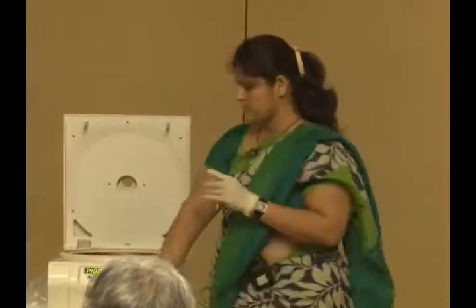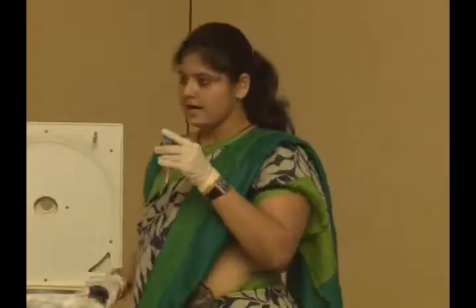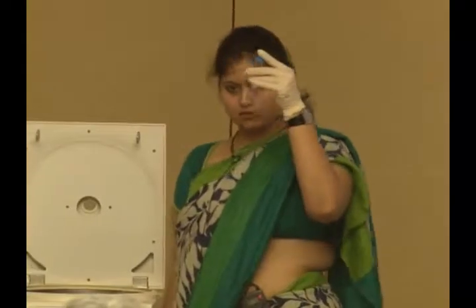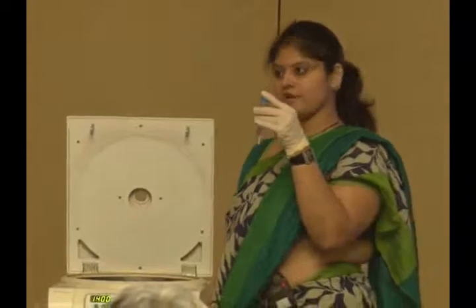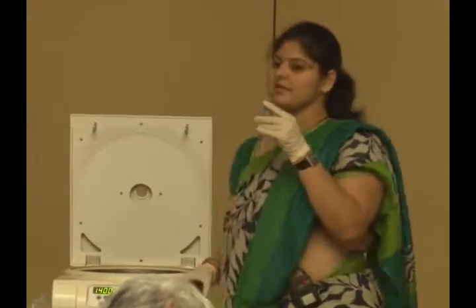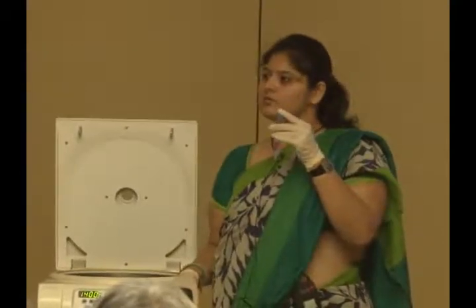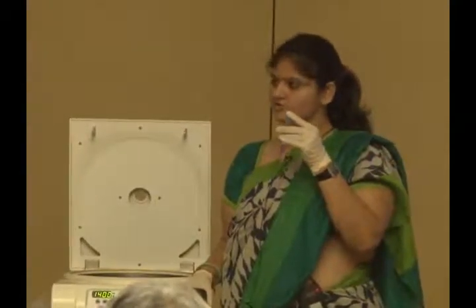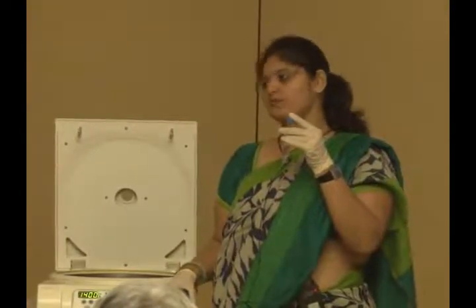You would like to add anything? We won't wait for the outcome. After preparing the tube, we will keep it in the centrifuge for 20 minutes at 1500 RPM. It is suggested that you use 300 G. Either you use 300 G or 1500 RPM, that is equal, or you can play around with 1400 and 1500 RPM.